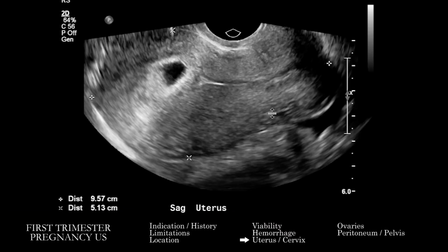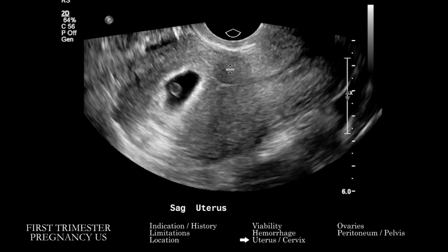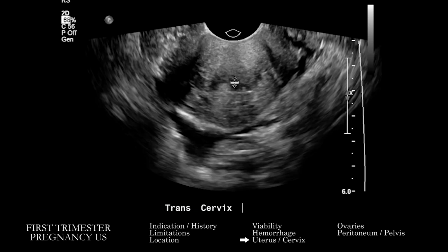We're going to go and take a look at the uterus. Again, in the usual sense, overall dimensions, focal lesions, post-procedural, post-surgical changes, C-section scar, things like this, and then look at the usual myometrium, endometrium, as is usual. We're capturing it a little bit here on these images.